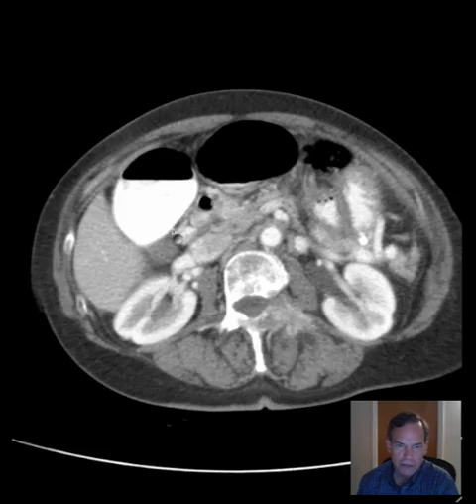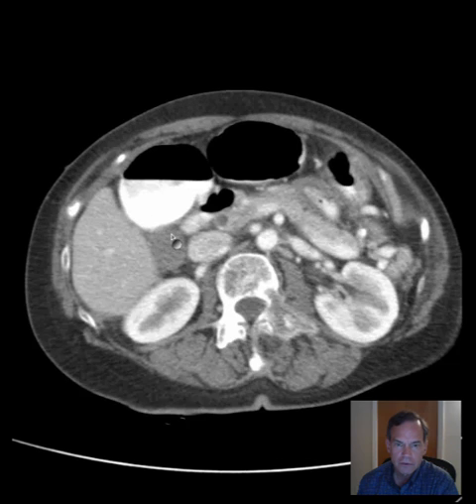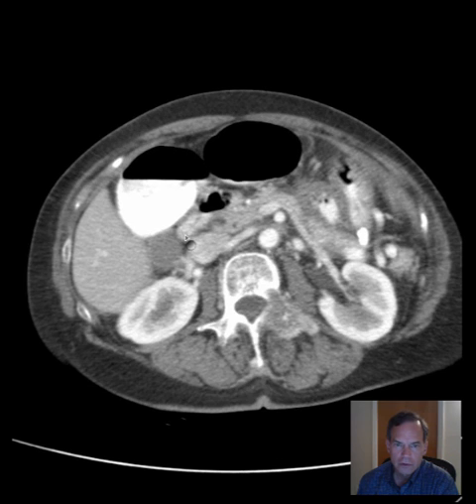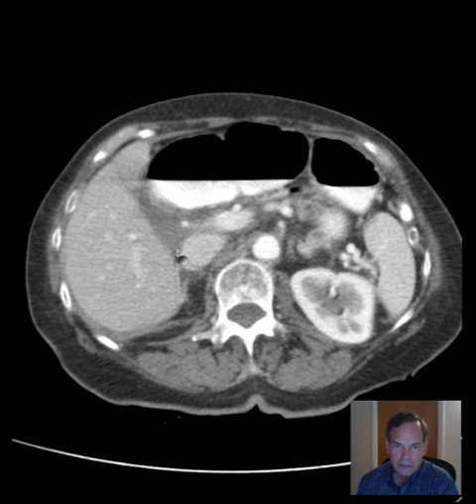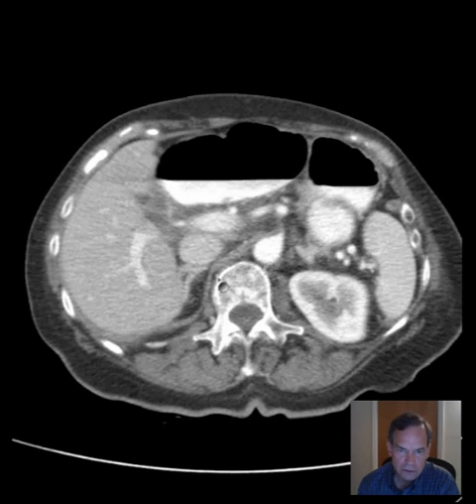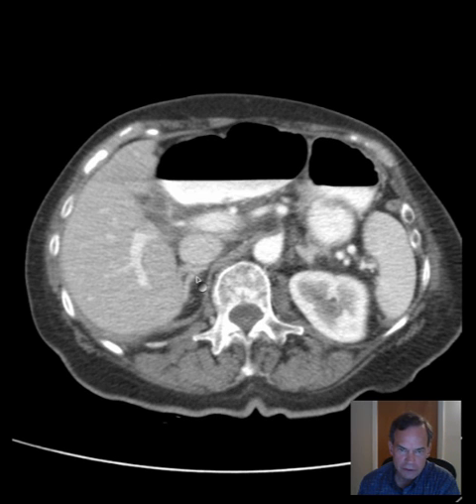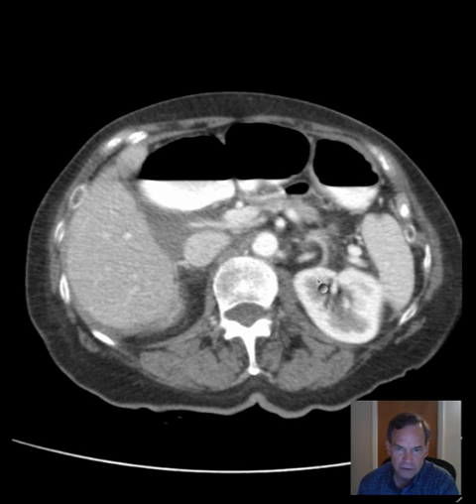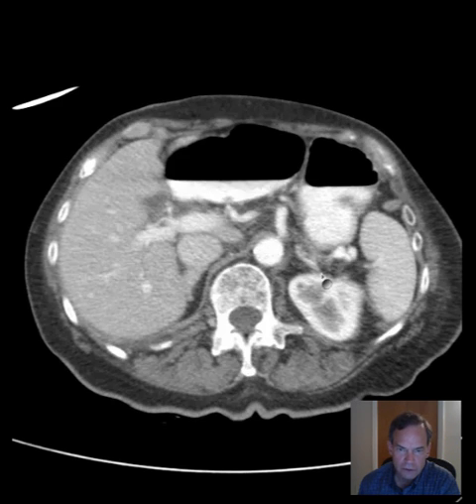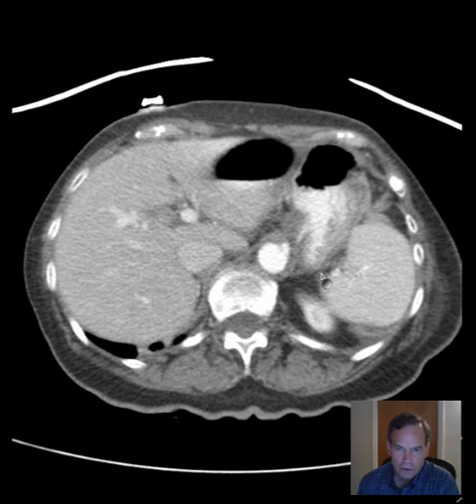The gallbladder looks fine. Now let's see how the adrenal glands look. You have to think about them to see them because they're not going to jump out at you like the liver or spleen. Here's one adrenal gland — it looks fine. The limbs of the adrenal gland look thin.